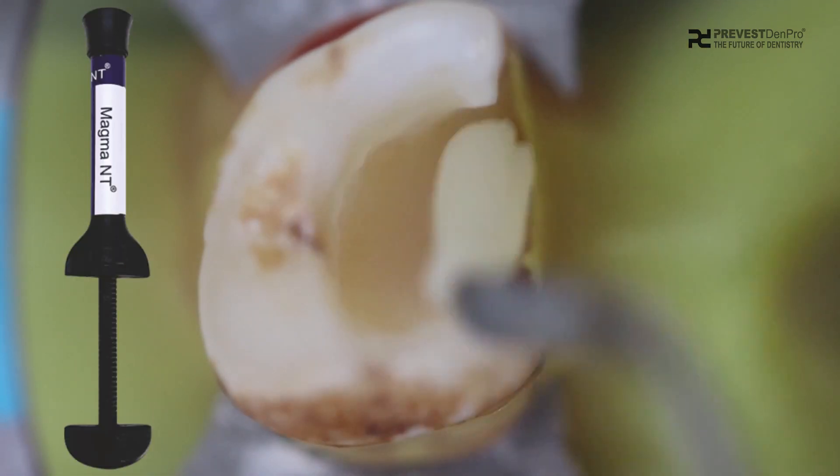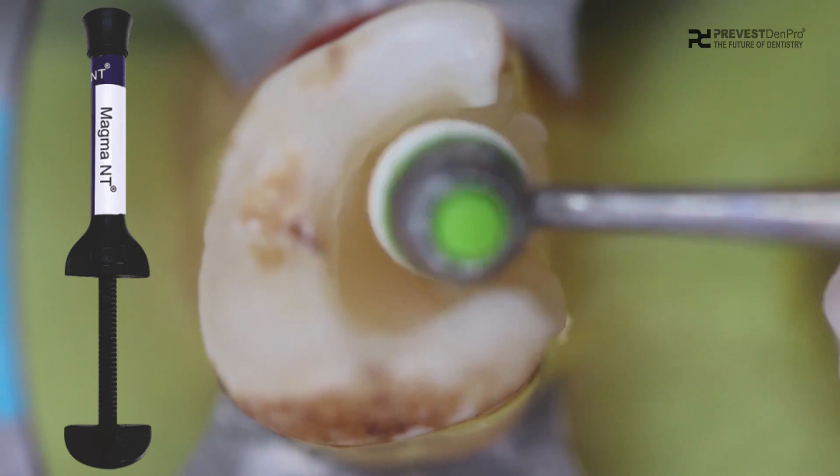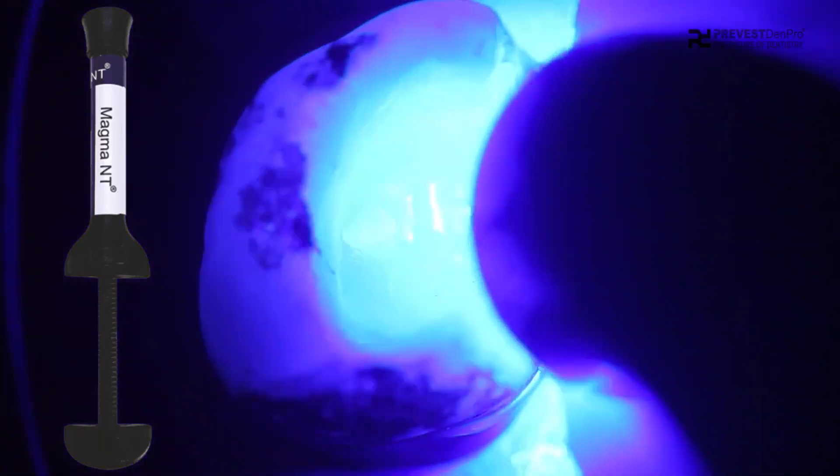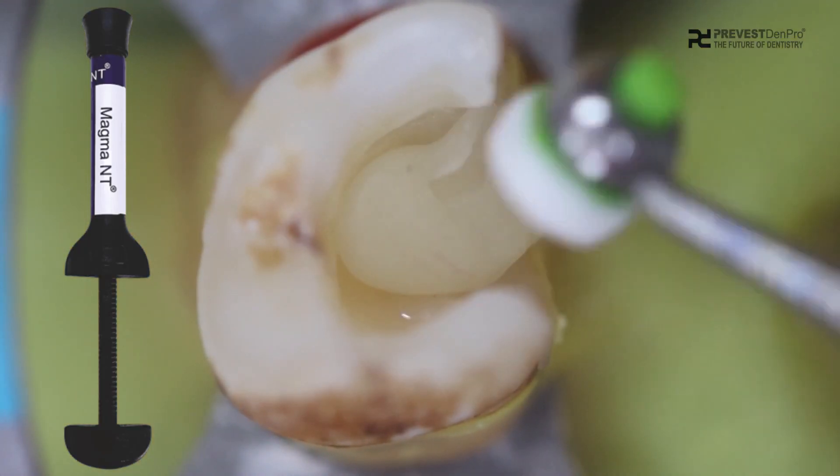Now we will be using nano-ceramic universal restorative, Magma Entry, which is a visible light-curing composite. This Magma Entry is a low-shrinkage composite that can be easily molded into desired contours due to its high viscosity.